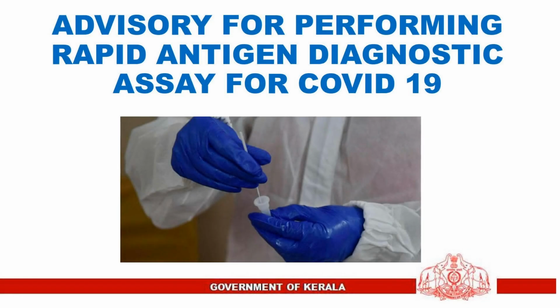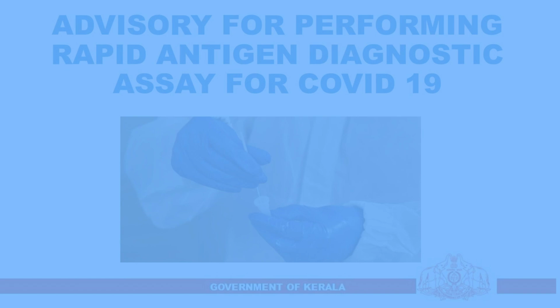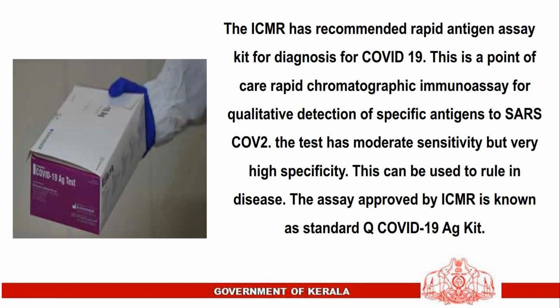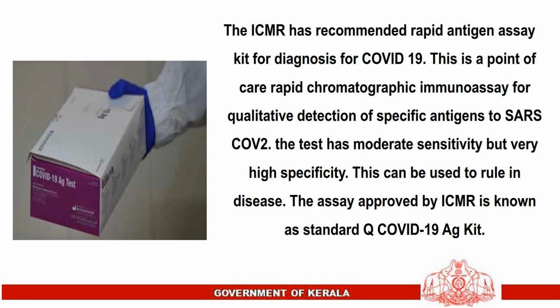Advisory for performing rapid antigen diagnostic assay for COVID-19. The ICMR has recommended rapid antigen assay kit for diagnosis of COVID-19. This is a point-of-care rapid chromatographic immunoassay for qualitative detection of specific antigens to SARS-CoV-2.